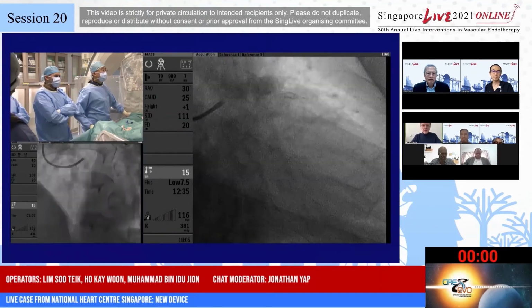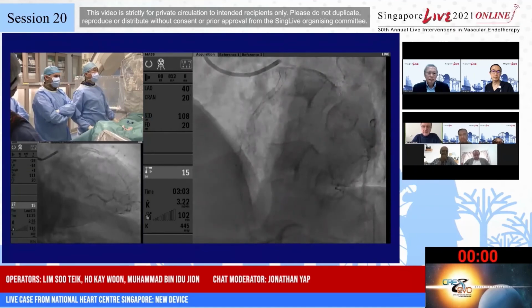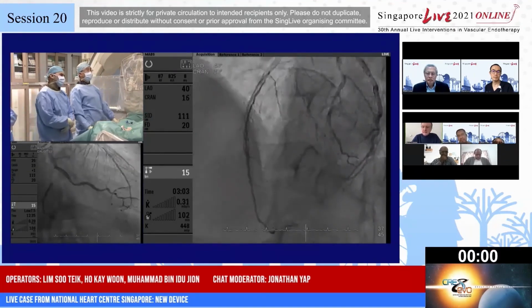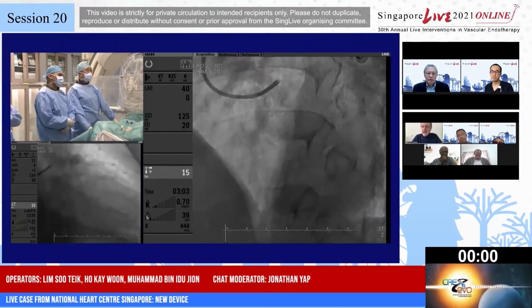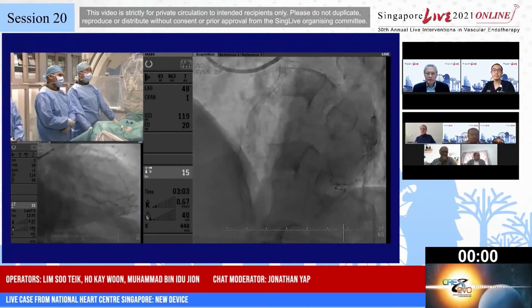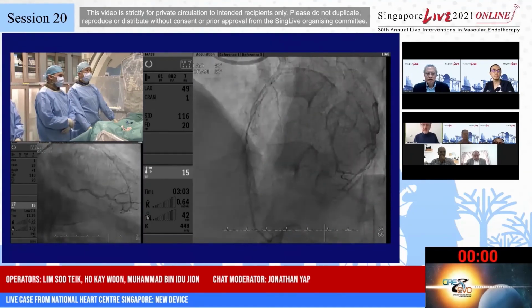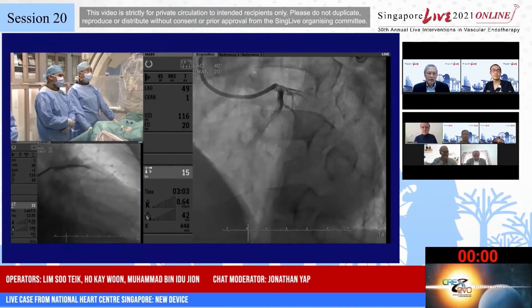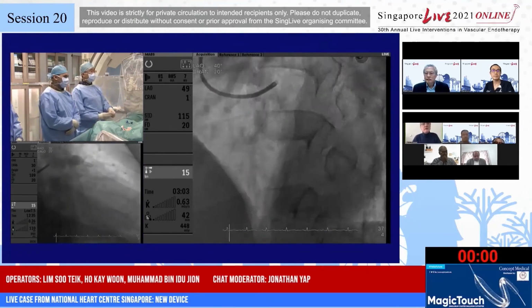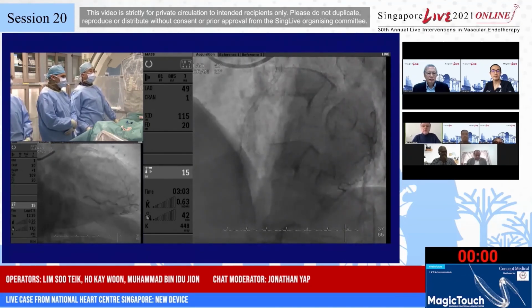I would love to see the OCT after 2 years, to see if you have a positive remodeling. This will be the key answer to all efforts. If you don't see positive remodeling, then it's a waste of time. But you need to collect at least 100 patients with complex lesions, because of course, not every patient will behave the same.